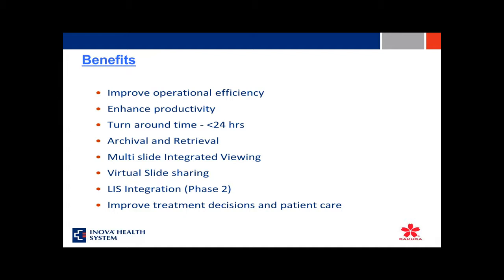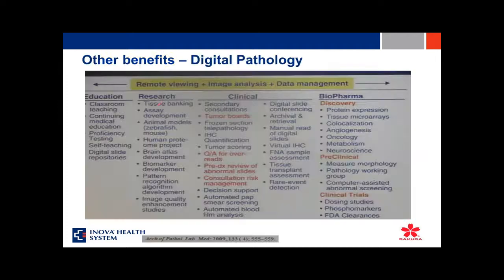And the LIS integration, which is a phase 2 project, is actually helping the pathologist not to deal with 2 different databases. It's actually launching the images from your LIS itself. So that's a phase 2 project. Just the last slide. There are other benefits for this technology in research, in clinical, in education, tumor boards, classroom teaching, and a lot of applications if you want to use this technology for.